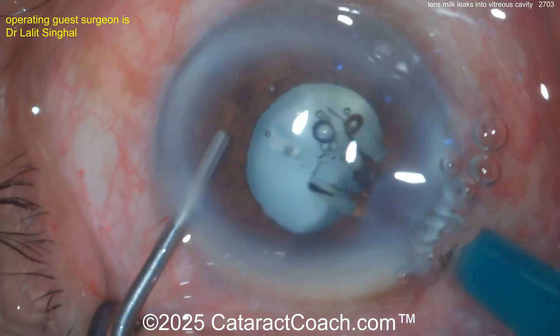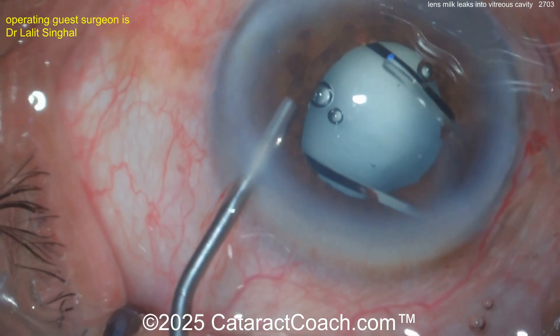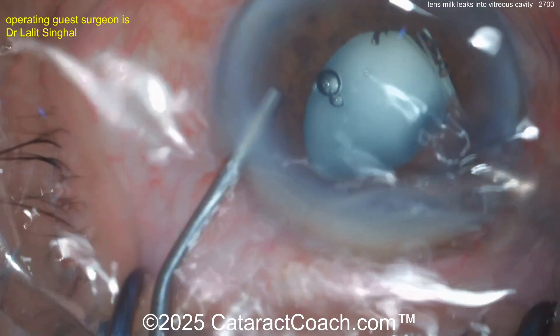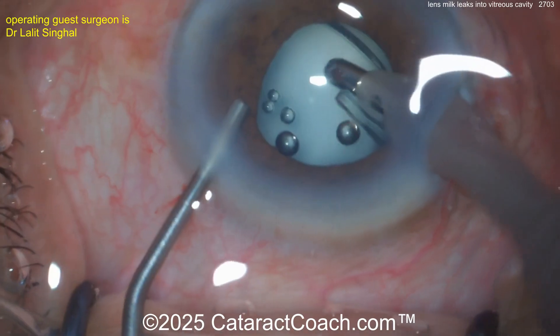Our surgeon is going to place the IOL in the capsular bag. IOL power was determined by non-optical means — using an A-scan to get the axial length measured by ultrasound. Let's get that lens in the bag. Here comes the IOL — positioning it completely in the capsular bag, getting both haptics in there.